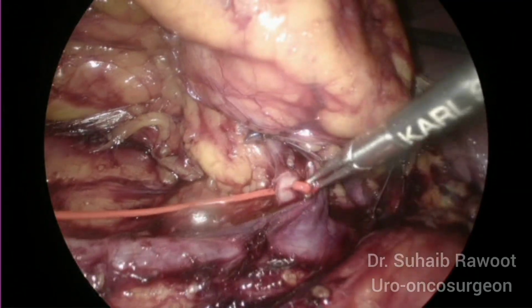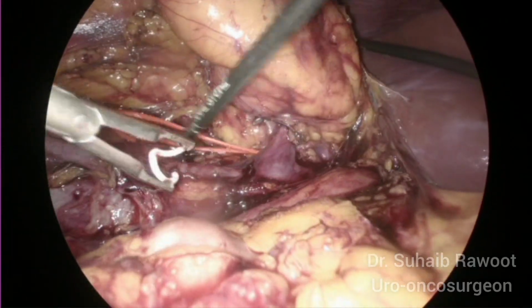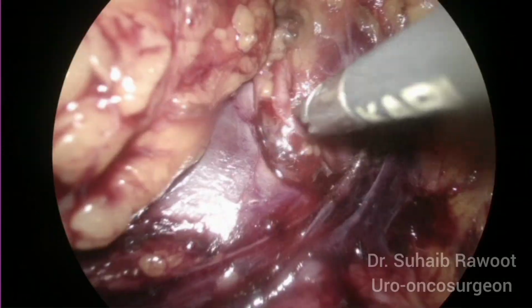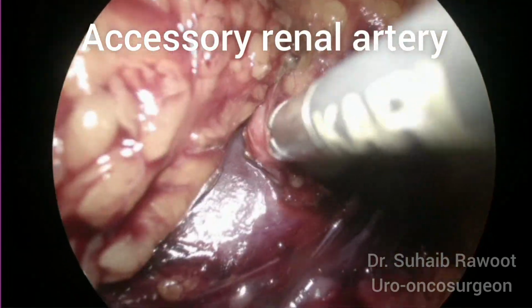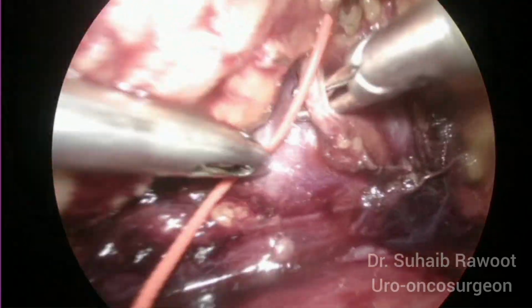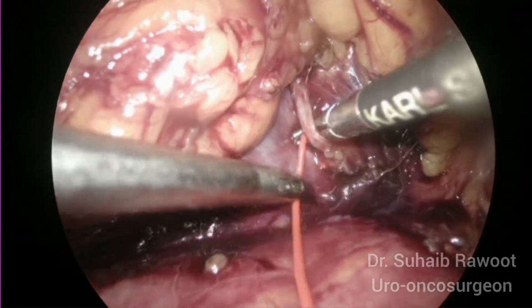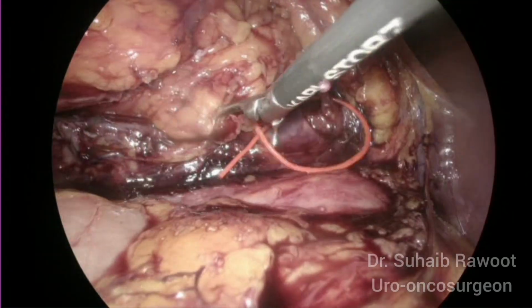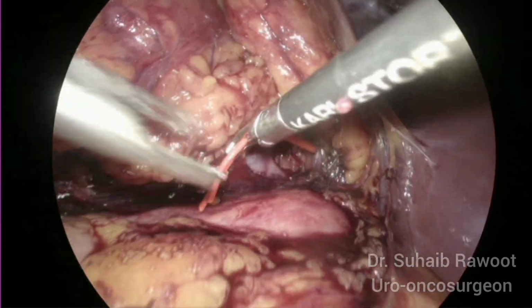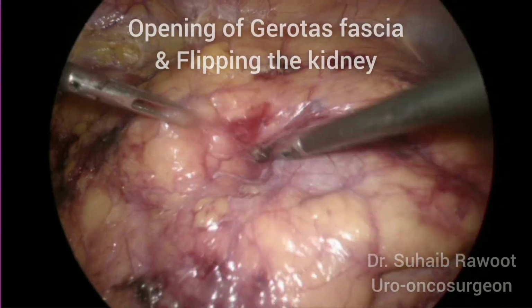So we are looping both the renal arteries. Looping of the arteries helps to easily apply the bulldog clamps.